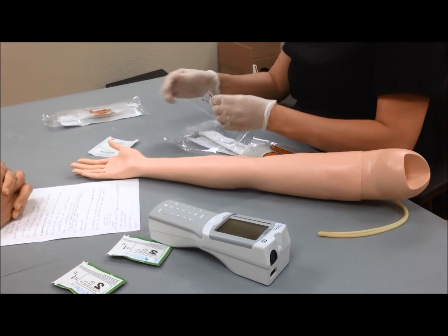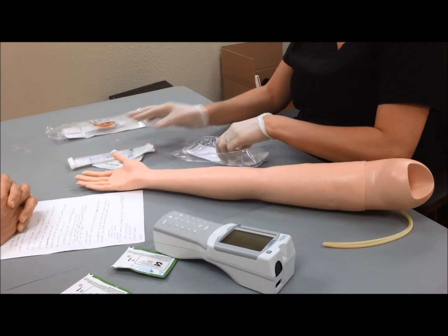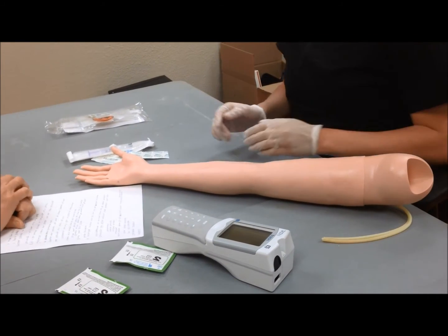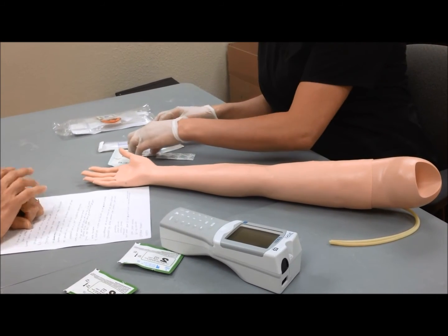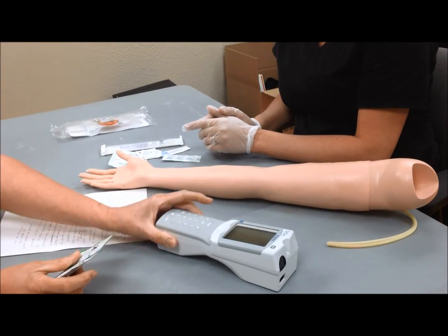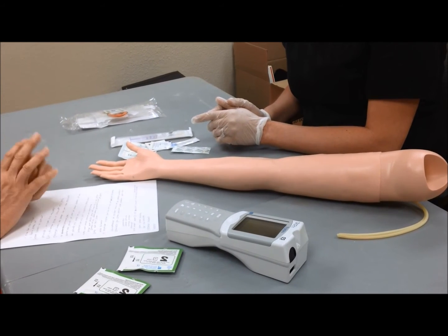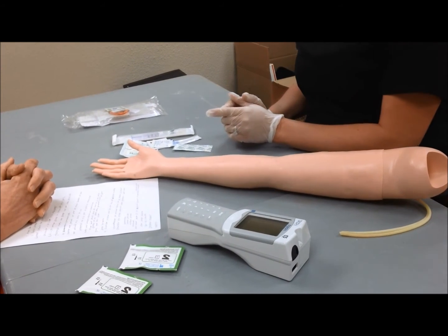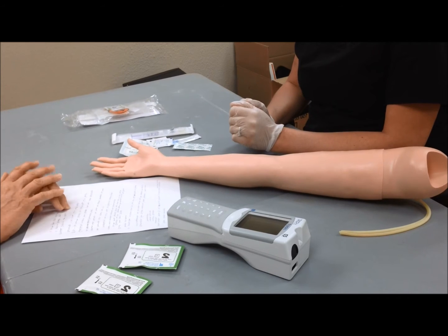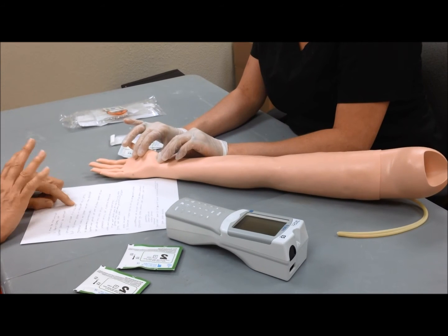Have your gauze, alcohol swabs, your syringe, which has heparin in it, Band-Aids, and a bag. You also need several cartridges for the calibrating iStat machine. They're refrigerated, so you need to keep them out for several minutes to warm them up. If possible, if you have a talking patient, inform them that you will be doing a blood gas on them. Enter the patient's room. Find the best area on the patient's arm where the pulse is the strongest. This may take a few minutes.